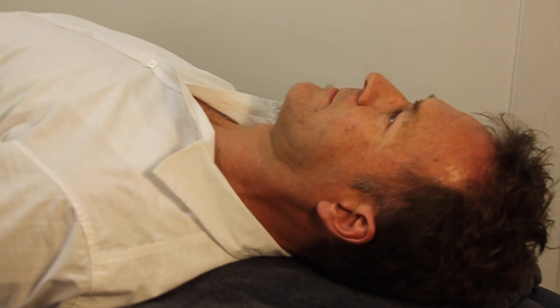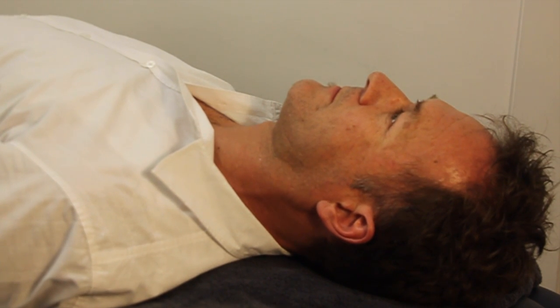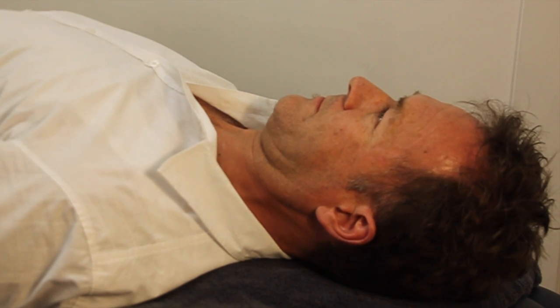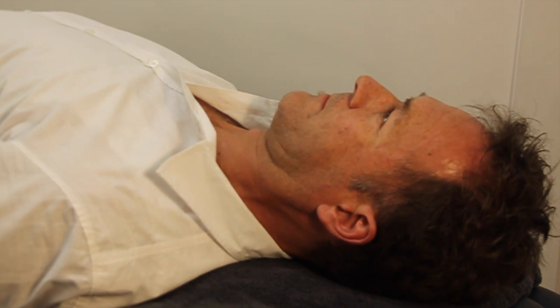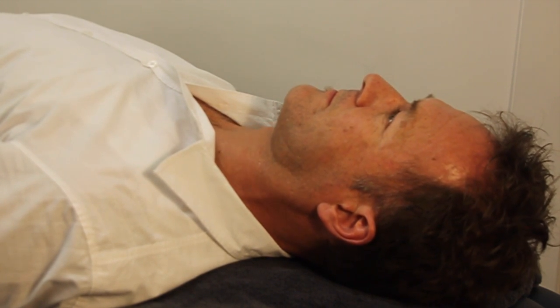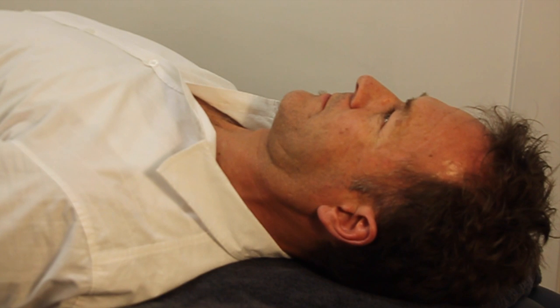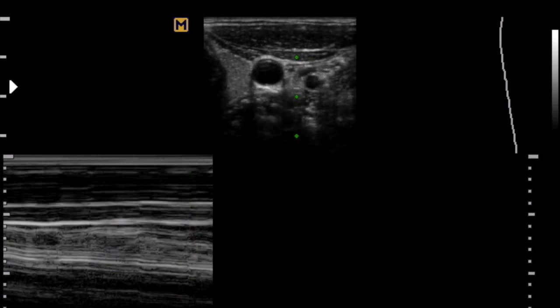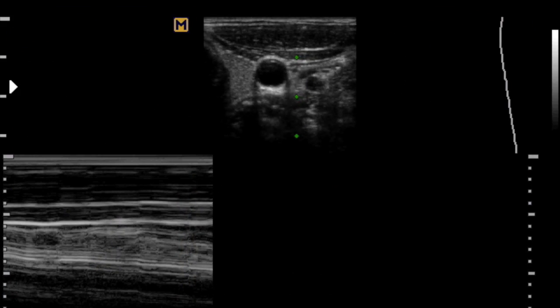Teach the patient to engage their deep cervical neck flexors by having them nod their head and gently lengthen their neck. The longus colli muscle can be viewed with M-mode during activation to assess its thickening during the contraction.